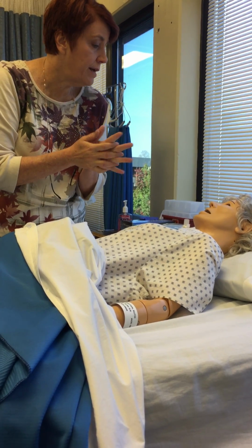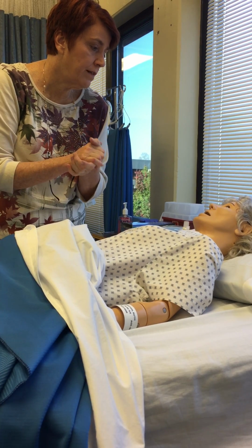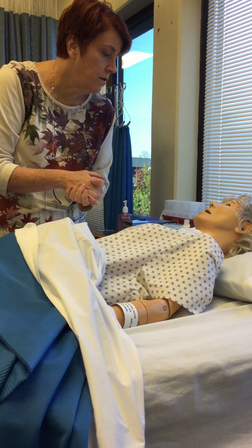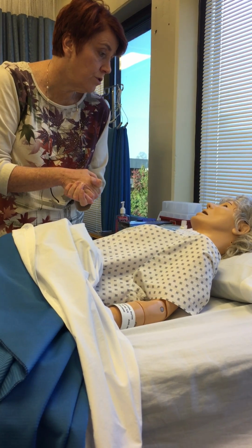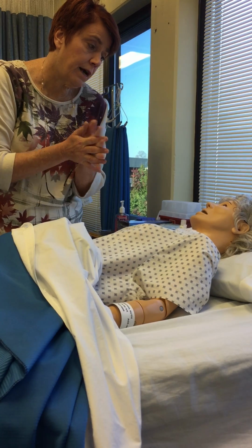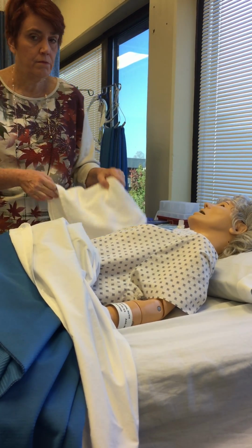Okay? Do you have any allergies? No? Do you have any problems laying flat in the bed with your legs up? No? What I'm going to do first is I'm going to wash you. Pericare, as we call it, but I'm just going to wash your bottom so we can make sure it's nice and clean down there. Because like I said, catheters can be a source of infection if we don't take good care of them. So that's what I'm here to do.